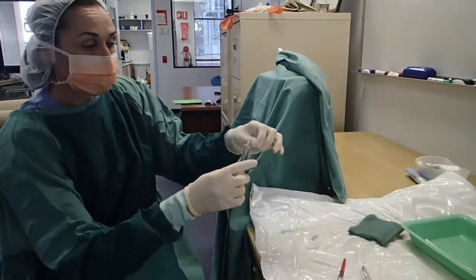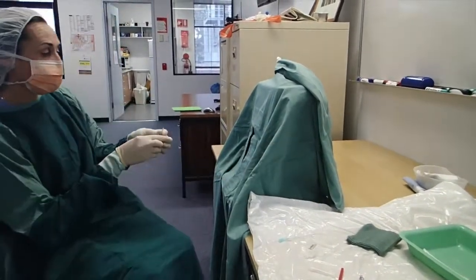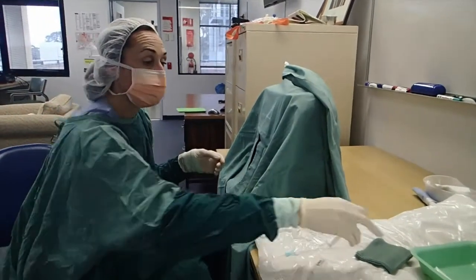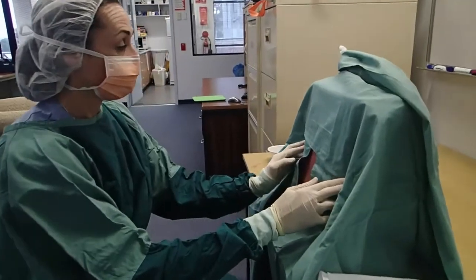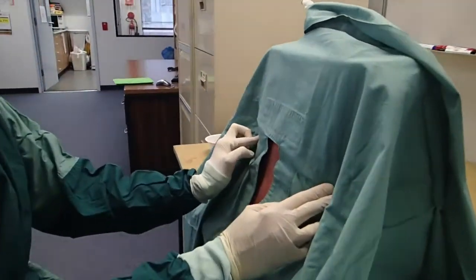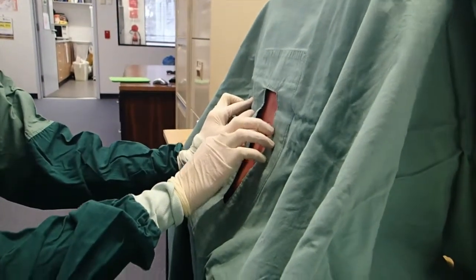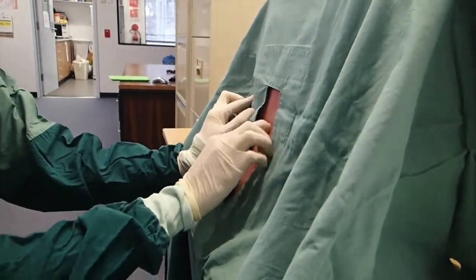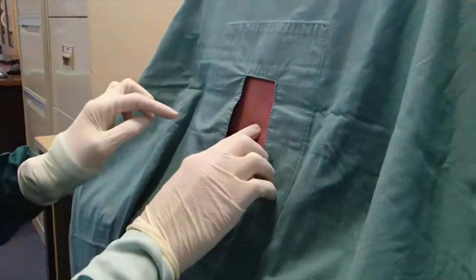And I'm going to attach a needle to it. And this is to numb the skin, but it can also be used as a seeker needle so that you can try and feel where the right space is. So I'm going to feel the iliac crests here. And then I'm going to put my finger down the midline, which is feeling the vertebra. And I can definitely feel there's a space between the vertebra here. Hard spot, spinous process below that spot where I'm going to inject local.